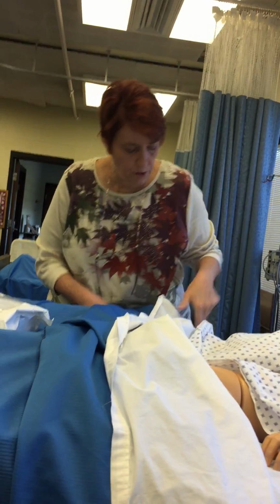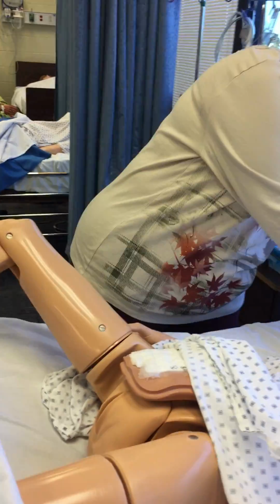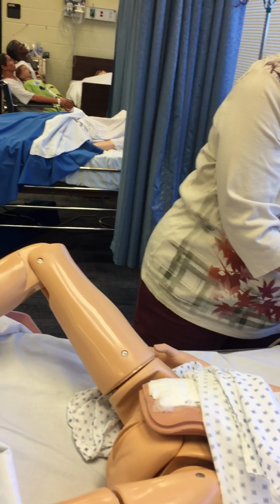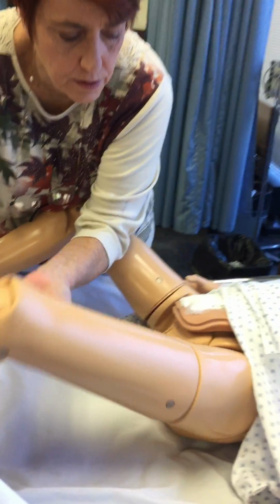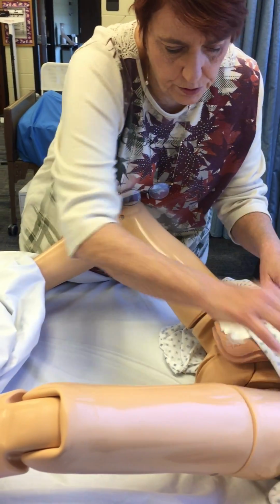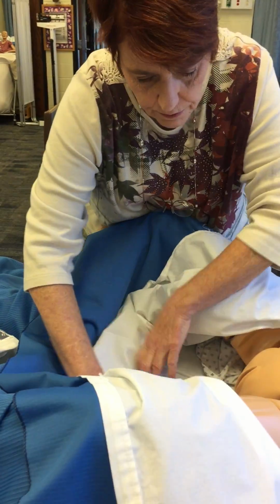Once again, we're going to position our patient in the dorsal recumbent position. Bend their knees up, if possible. I put her bed a little bit too high. Put her knees down. Good enough. This is the dorsal recumbent position. See if they can abduct their hips if they're able. This makes a very good field for you. And cover this much up if you can. Keep as much covered as possible.